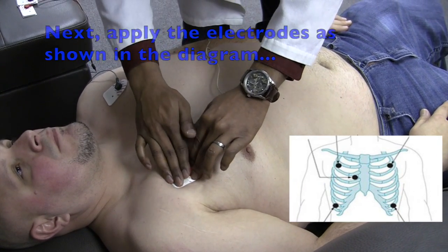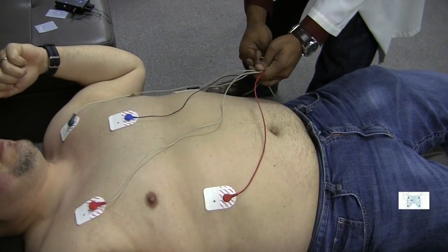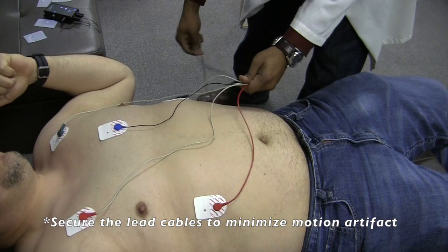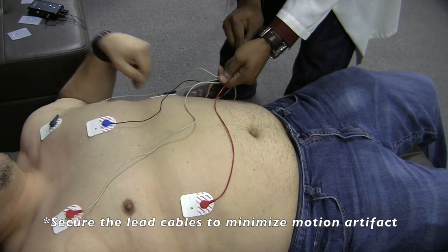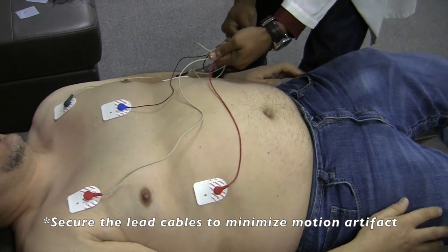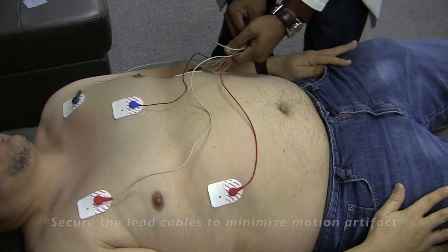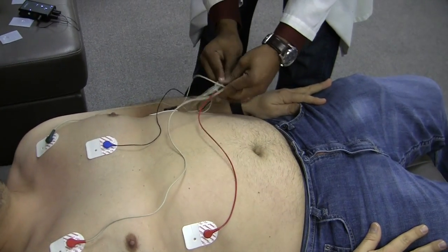Once the subject is hooked up, secure the leads with surgical tape to minimize motion artifacts and ensure a better signal.